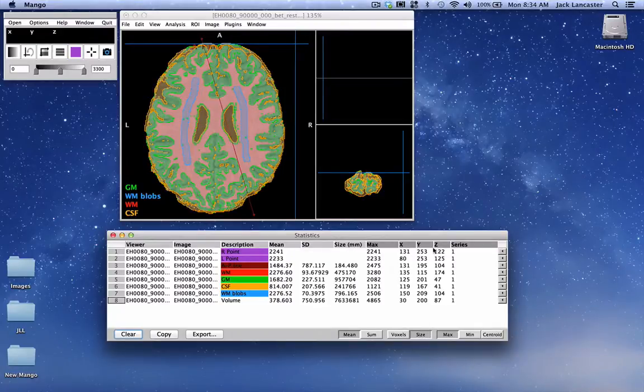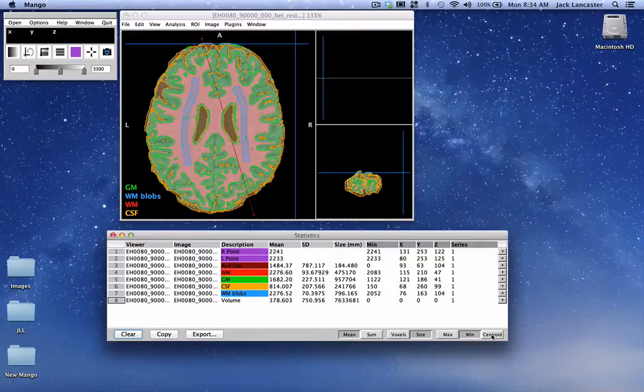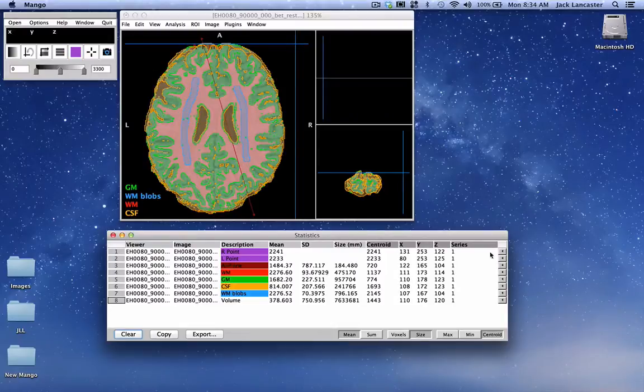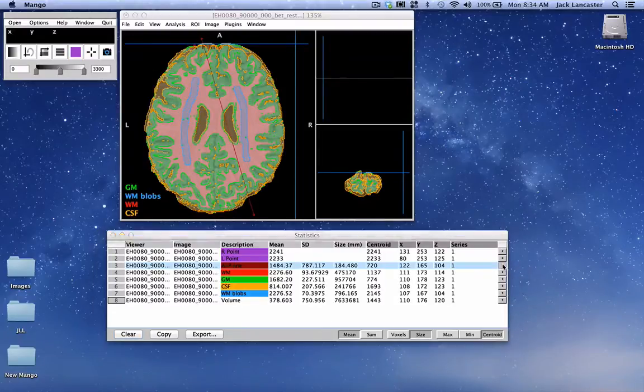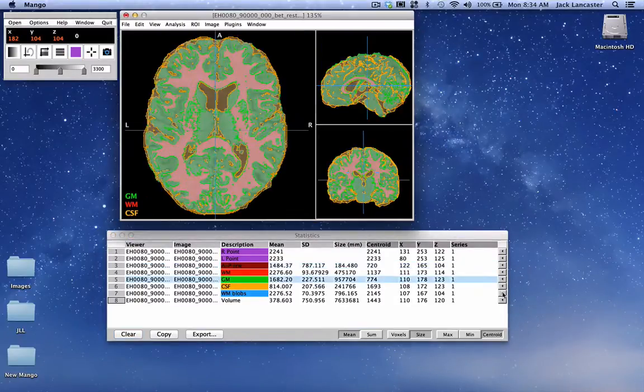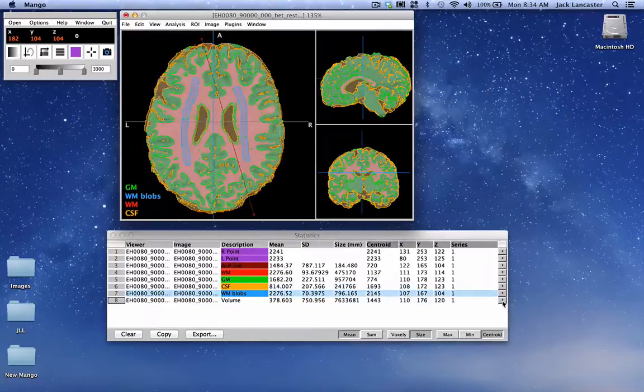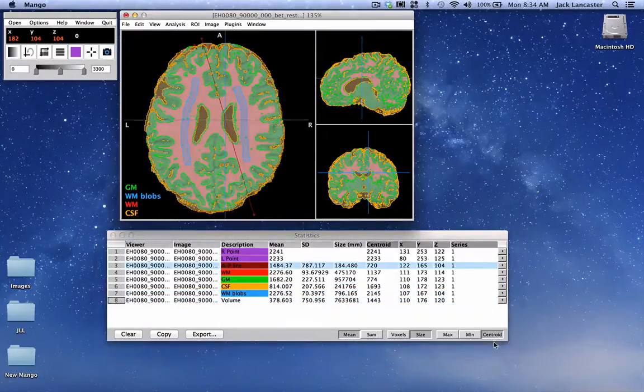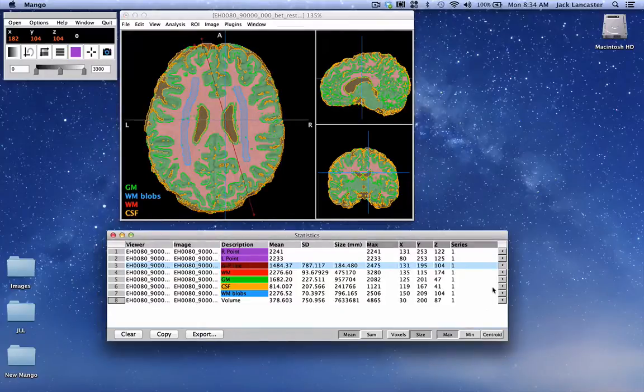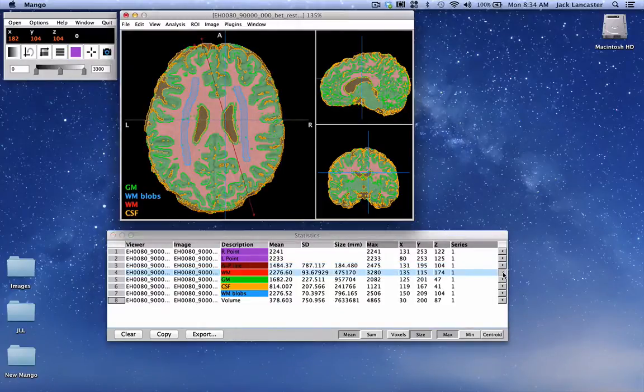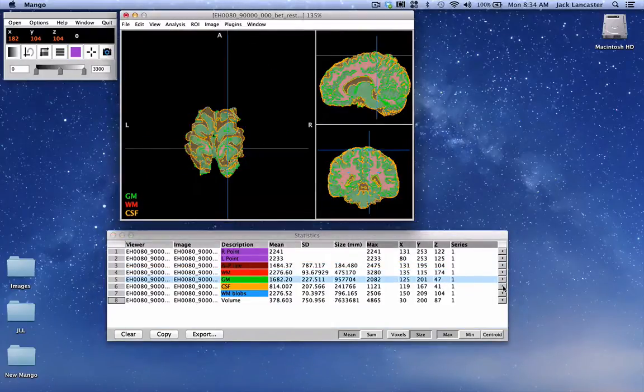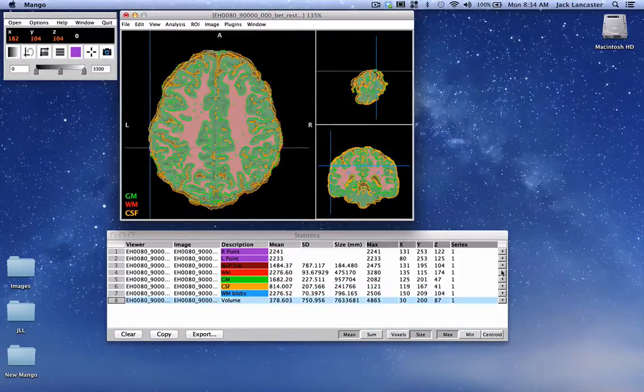In the last four columns, this is currently set up to show us the max value in the region. It can also show you the minimum value and the centroid, which changes the location. The reason I'm going over this is that you can navigate to each of these objects now by pressing the little button on the side, and you're basically navigating to what this feature is. The max is probably better; max is guaranteed to be inside a region, centroid might not be.